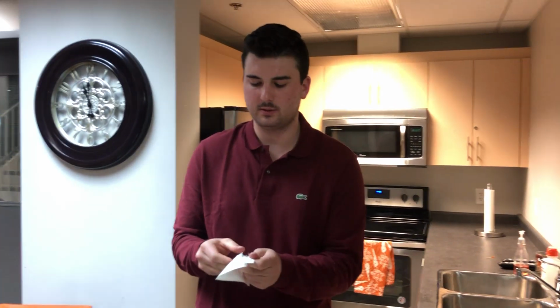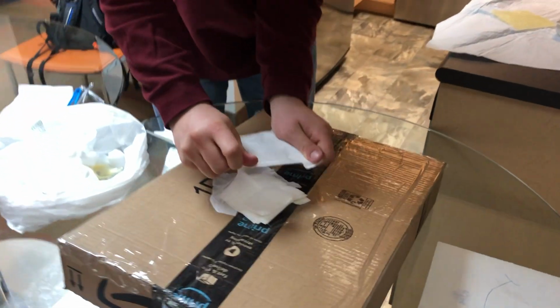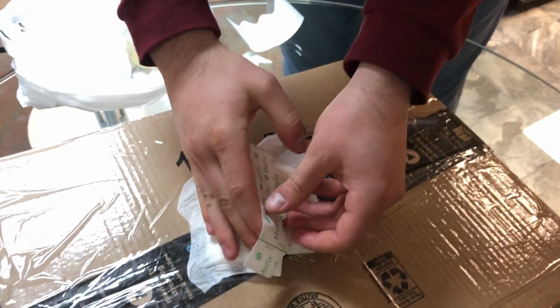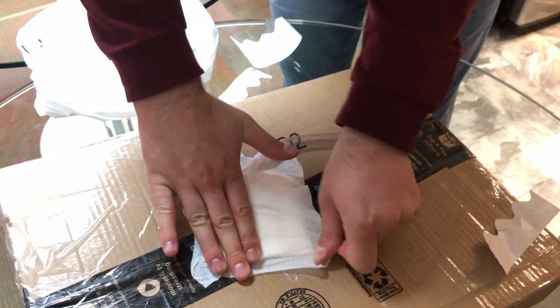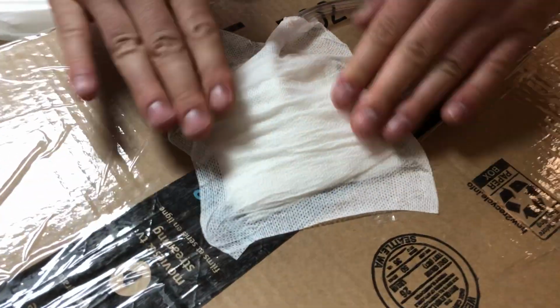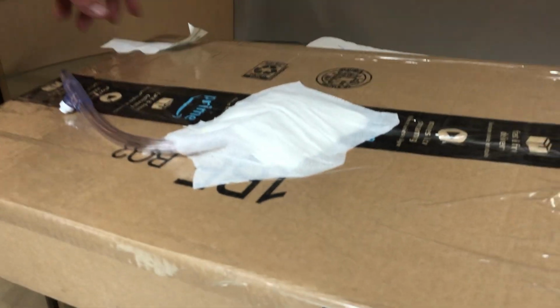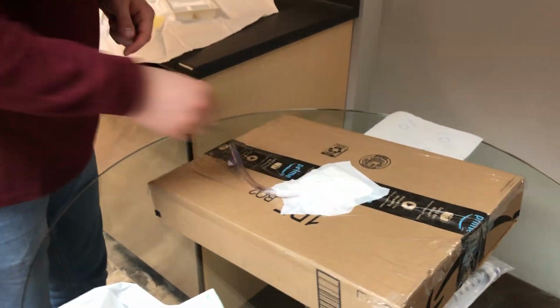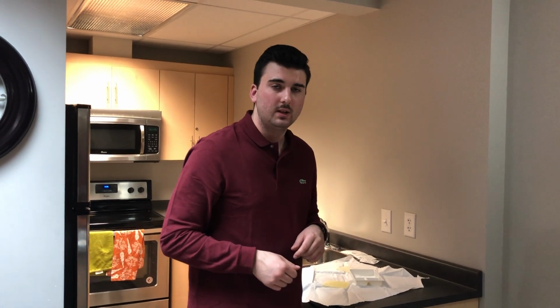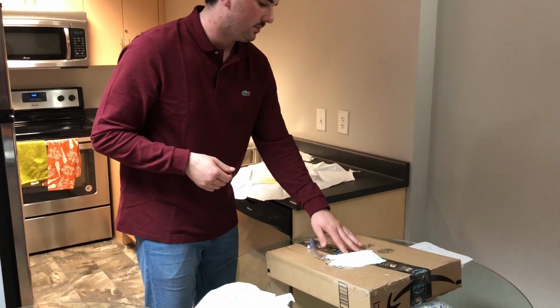We can add the other piece here. You want a nice tight seal to almost create pressure so that it stays secure to the skin. So we're holding everything in place nicely. Good, and then at this point what you can do is write directly on the dressing when it was done, the date and time, and then my signature. And then I can document that the dressing change was done in the EPR, and then come back later to make sure that the patient's still okay. Thanks.